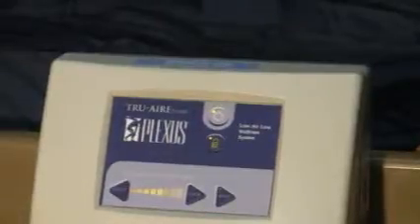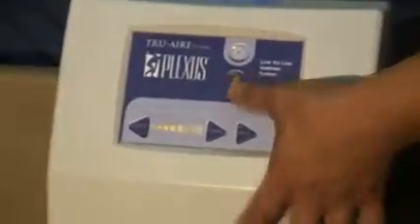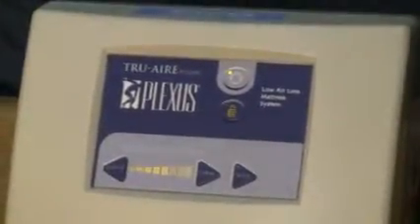To activate and deactivate your lock mode, you would want to press your lock button down, hold that down for 3 seconds, and that will deactivate it or activate it.